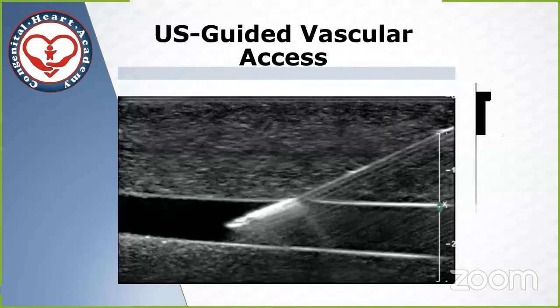One of the things that I want to spend a couple of minutes with is the ultrasound guided vascular access. That has probably changed the way we practice medicine over the last 10 years. I remember when we started to use it back in 2005, 2006.